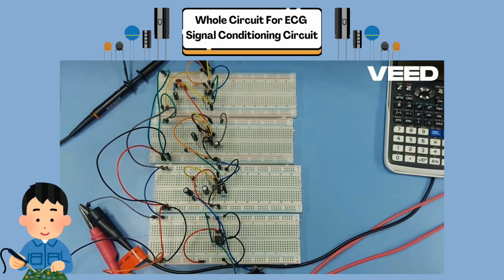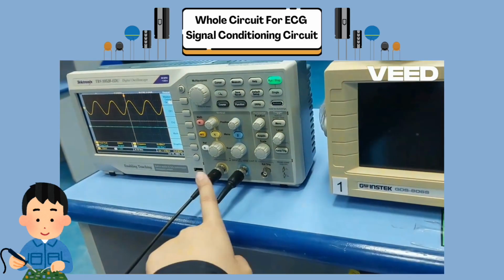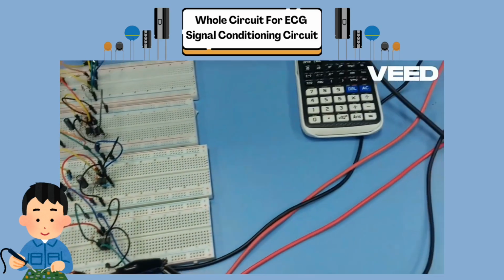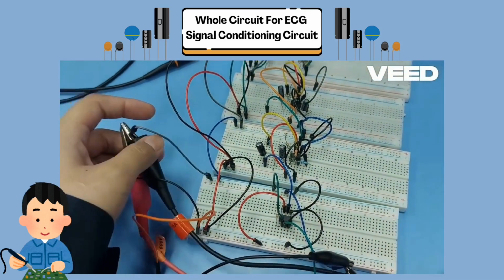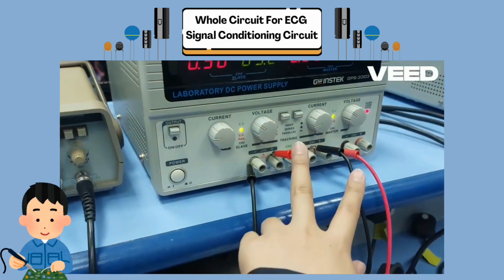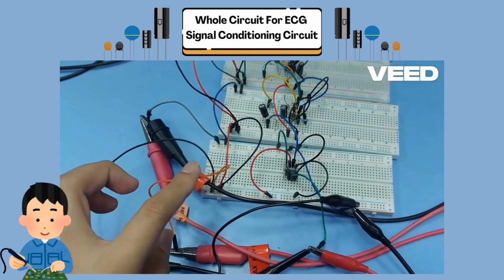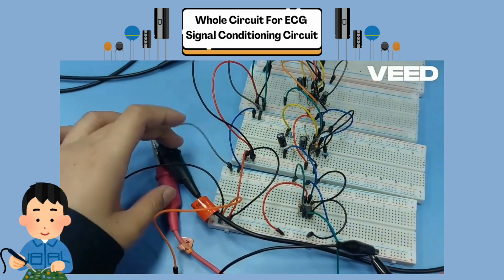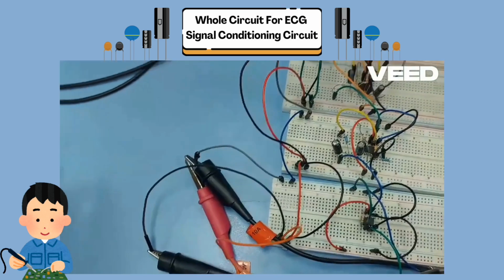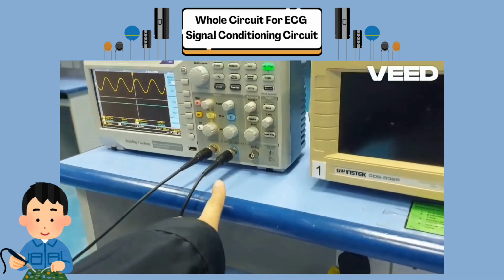This is the final circuit for our mini project. First, pin 3 of the AD620 amplifier, which is the input, is connected to channel 1 of the oscilloscope, which displays the input, and connected to the function generator. Then the ground for the breadboard is connected to the ground for the power supply by combining the positive and negative. The orange wire in the breadboard, which represents the power supply, connects to the positive polarity of the power supply. And then the negative polarity of the power supply is connected to the black wire. Lastly, pin 6 of the amplifier in the notch filter is connected to channel 2 of the oscilloscope to display the signal output for this project.